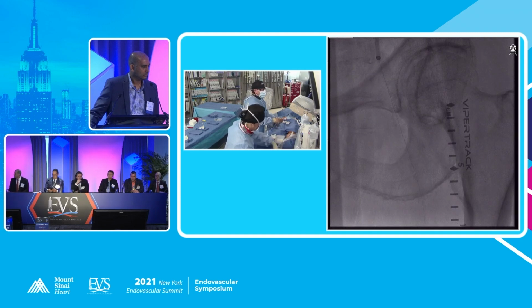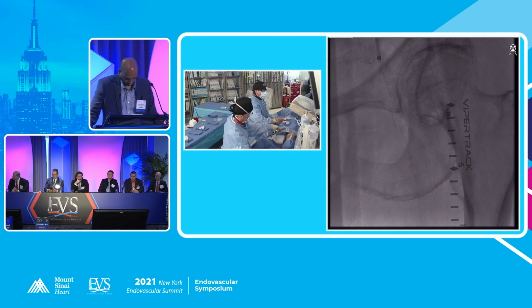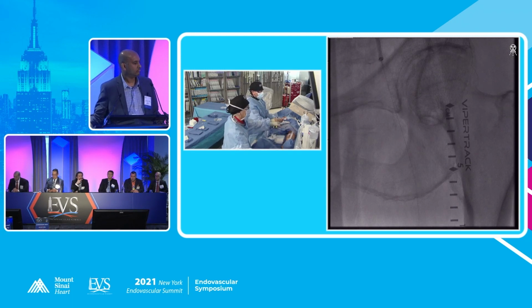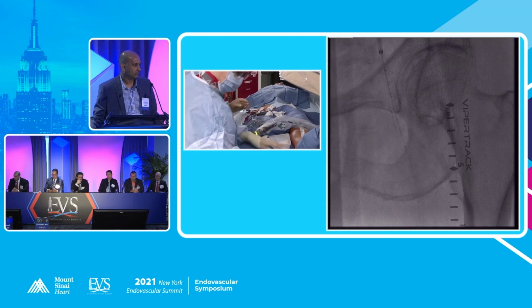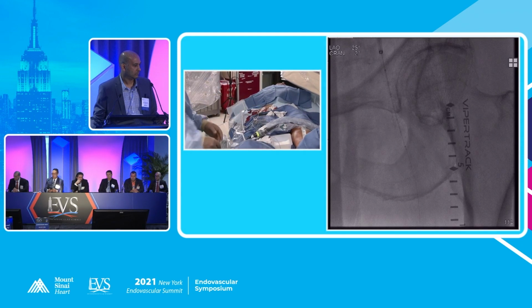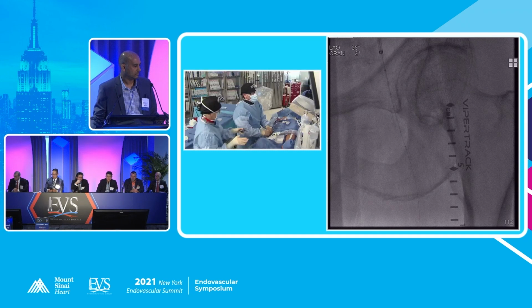Okay. All those things said, I really think that if we've got a wire through and through there and a drug-eluting scaffold to the posterior tibial artery, the chances of a meaningful bad thing are pretty low. Now, we can fix a lot of the cold feet here. You're right, I wouldn't want to have our surgeons on a Saturday have to fix a cold leg. But I think the number of times that happens, if you do this correctly, is pretty low.